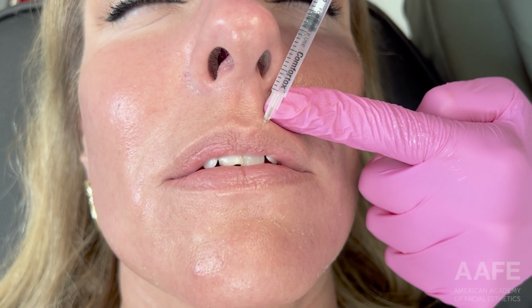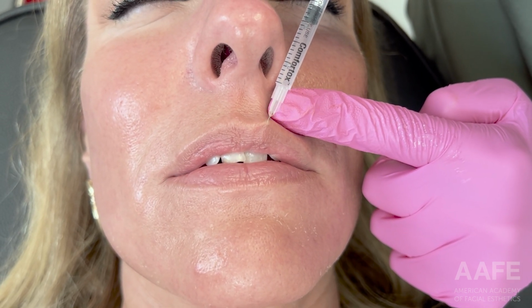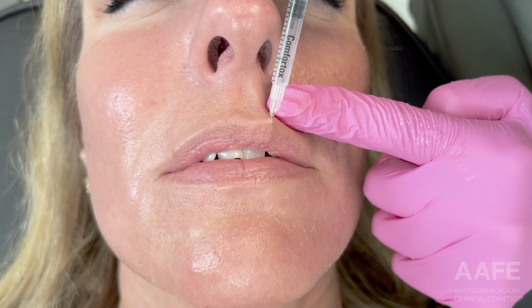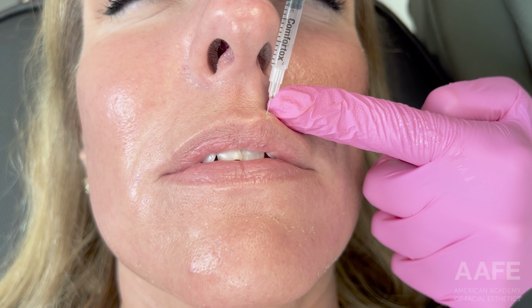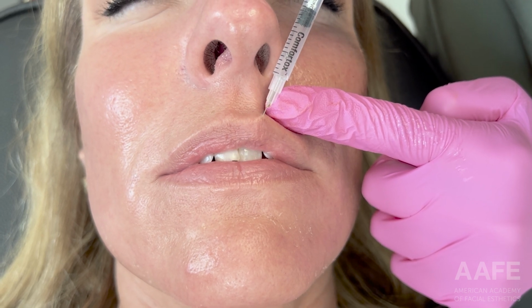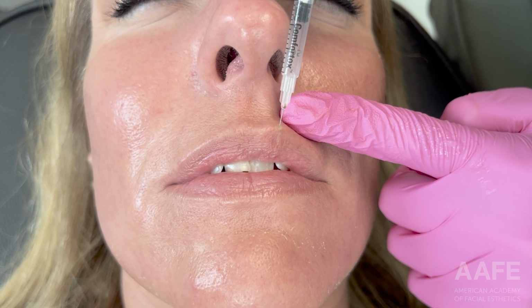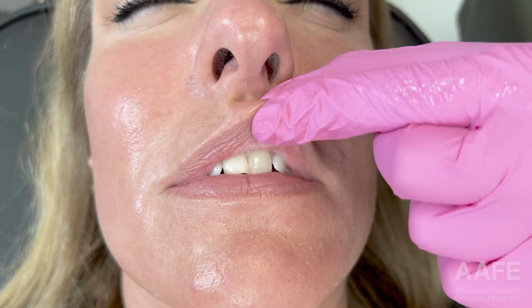Today I'm just going to walk you through a little bit of a treatment on my patient that I did where I'm focusing on her lips. She is actually a lip filler first timer, so she's getting her treatment done for the first time here. And I did backfill my syringe, which is something that we teach in Master Lips or Level 2 dermal filler courses. So I'm just working on her.